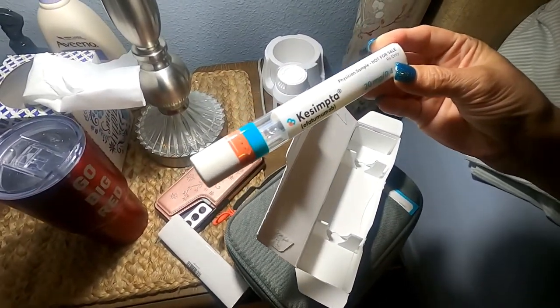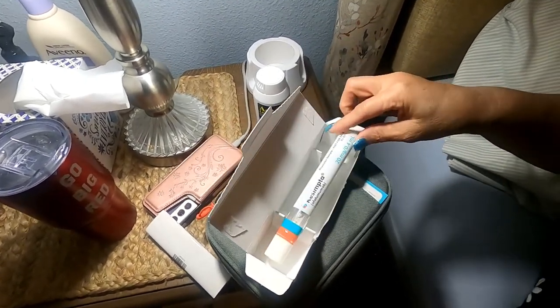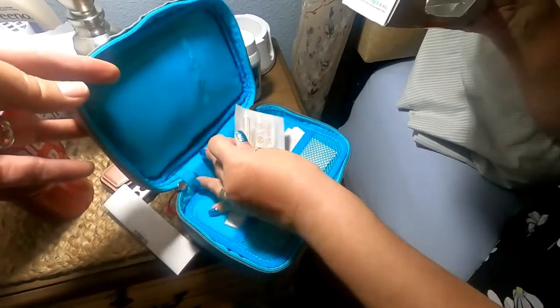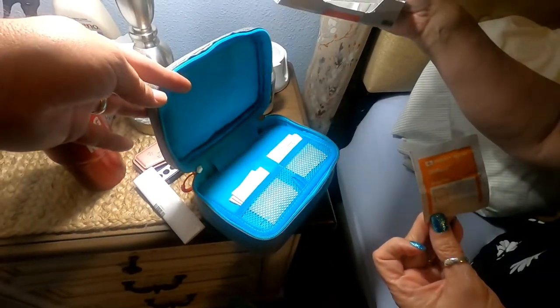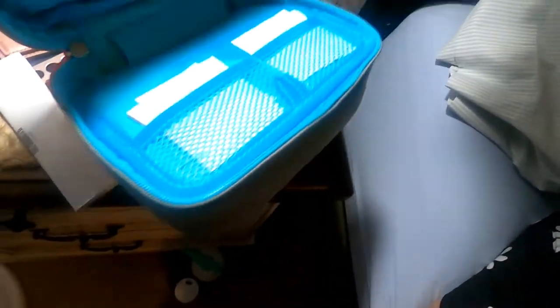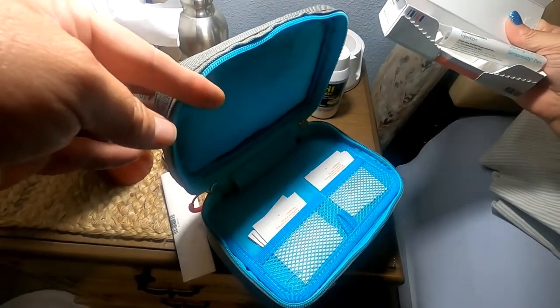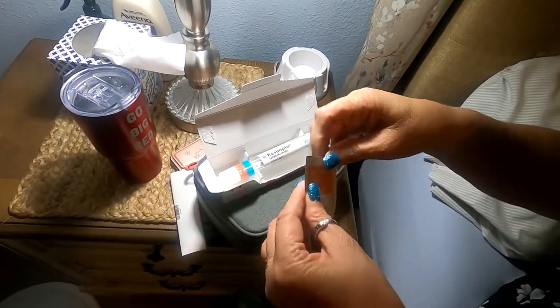I took this out about 40 minutes from the fridge because you have to keep it refrigerated. I washed my hands really well and I'm going to grab a sterile wipe. This is my little case they gave me for transporting — there's an ice pack on the other side if I need to travel. So go ahead and put that down, and let me tear this open.